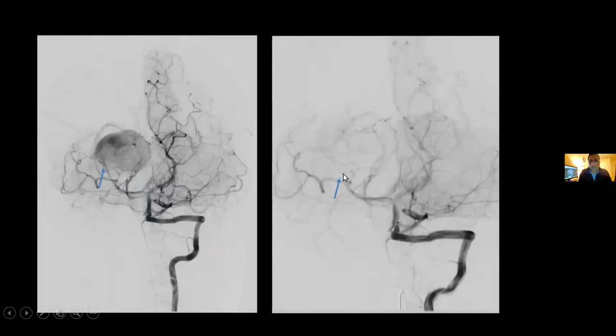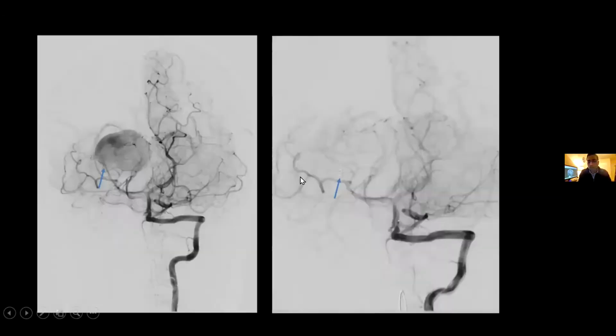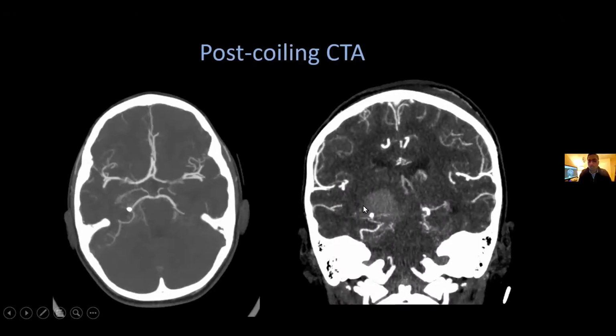So we sacrifice this artery by one or two coils over here, you can see, and there is the CT following. Obviously, this artery is going to be taken over by collaterals, but this territory was anyway closed because the artery is dissected over there. And this is a curative treatment, and we don't expect this to recur. This CT was done 1 year after the treatment.